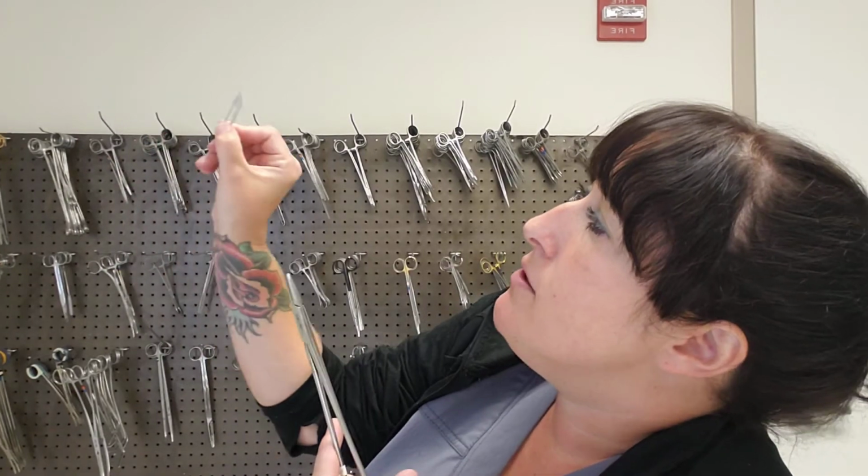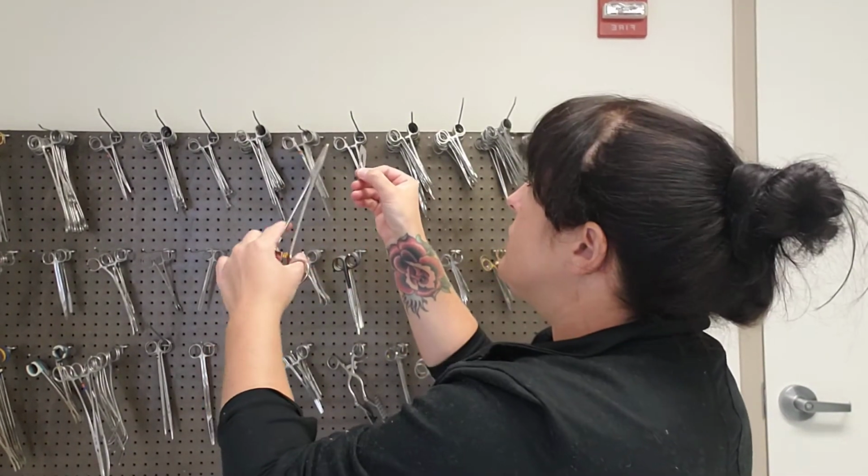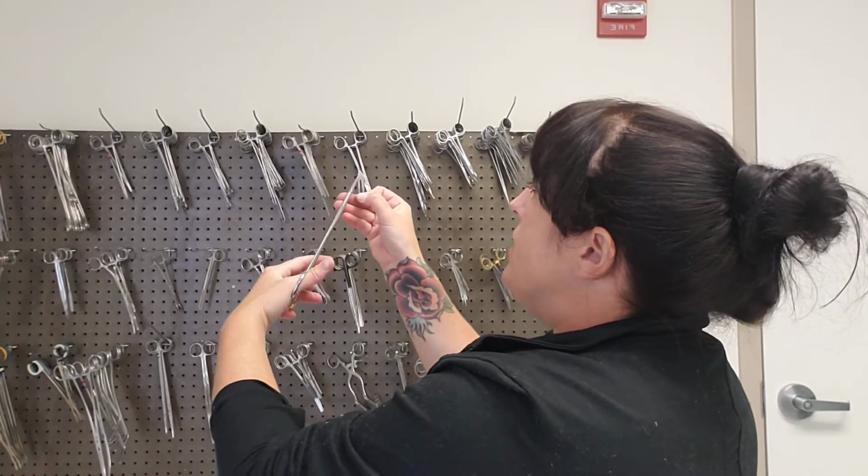All right, so your 3 is going to be your most common. A lot of your initial incisions, you're going to be using either a 10 or a 15 blade on a number 3 knife handle. Now, the way you load these is you're going to use your right hand, and you're going to have your blade pointed out, and you're going to grab it right here.